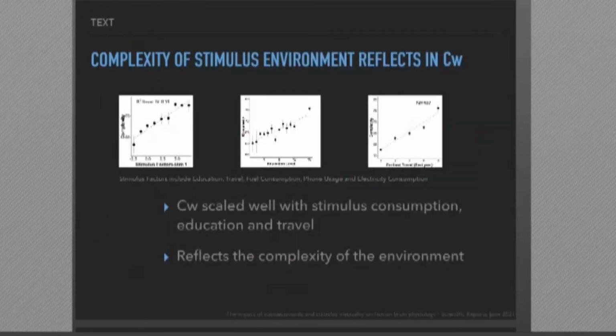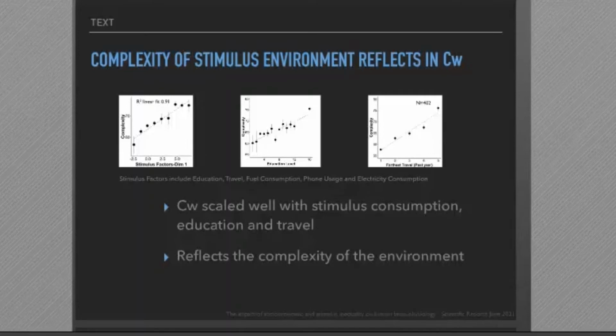I'll move into some of the studies which we've done where complexity is integral to interpreting the stimulus environment. So this is data from a study done in Tamil Nadu in India. Tamil Nadu is a southern state. It's quite industrialized. We've got EEG recordings from 402 participants.